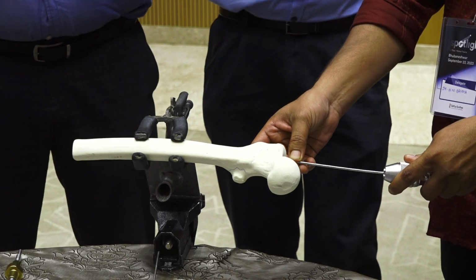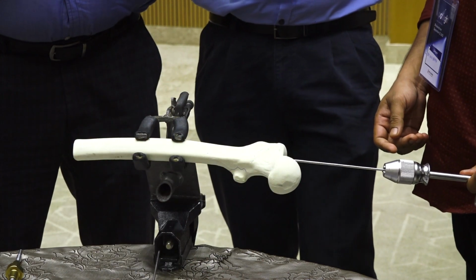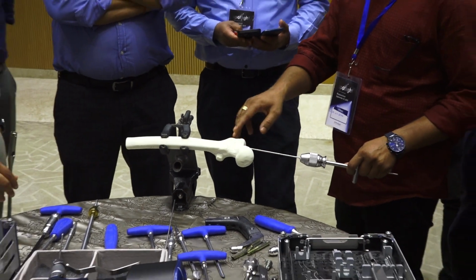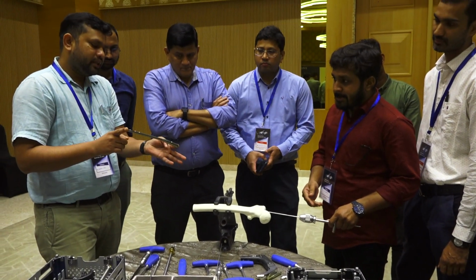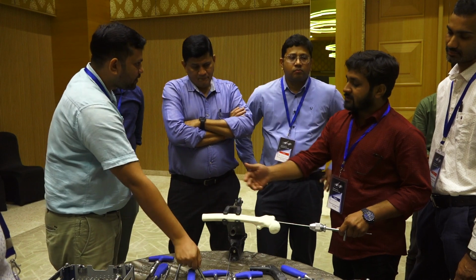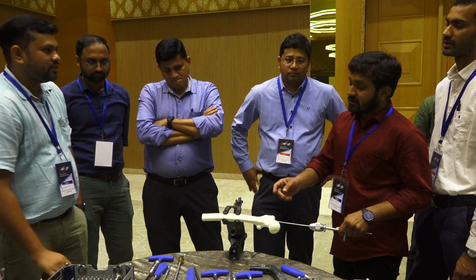Posterior. Why? Because of the anterior bowing of the femur, sir. It will hit the anterior cortex. I will start slightly posterior and I will direct my nail anteriorly after passing the mid shaft. If you go posterior, the nail will also have a bend, and the end point will touch the anterior. That's what I am against saying. After passing the mid shaft, I will lift the jig and redirect my nail. I am not actually trying to reduce it with the nail.